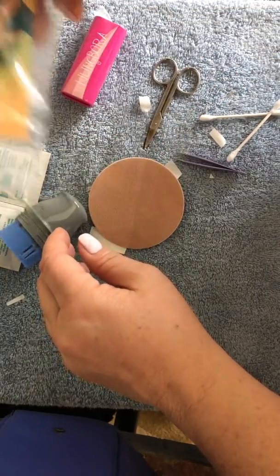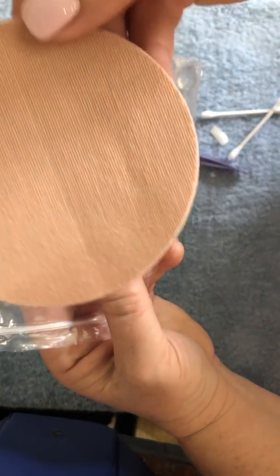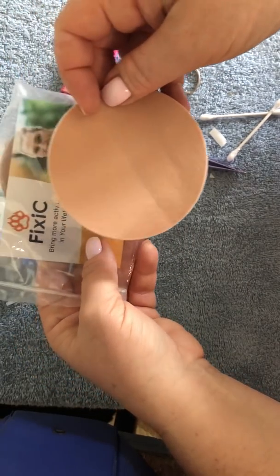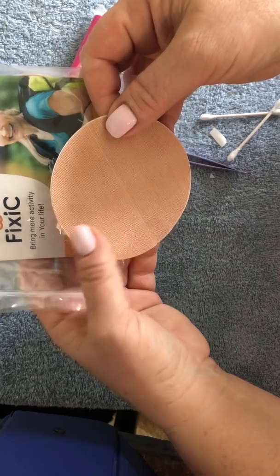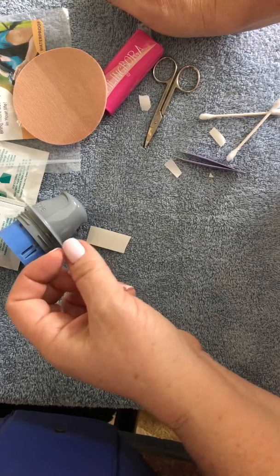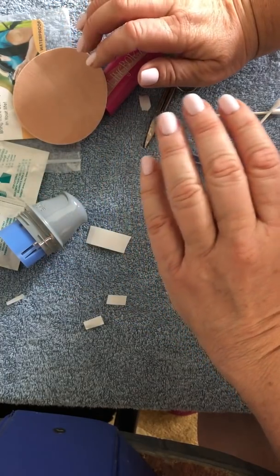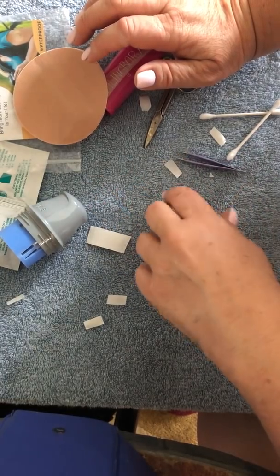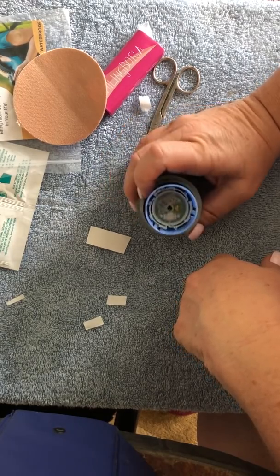And then when it's all done, I take one of my, these are called Fixic, see? I take one of these patches and I put it on top of it. And then I use a little bit of rubbing alcohol to remove any of the leftover skin tack that's on my skin. These will stay on your skin for 14 days. I've never had any problem. I've done this now for 4 sensors, and I have never had a problem even bumping into doors with it coming off. So this is a great way to get rid of the adhesive and still enjoy the benefits of your system. So hopefully this helps for all of our English viewers, and you can get to doing this.